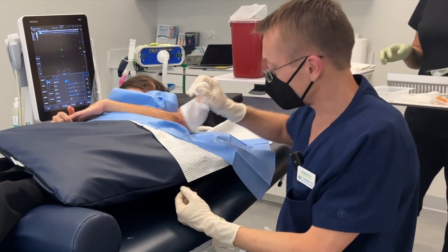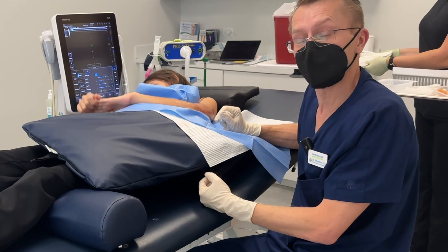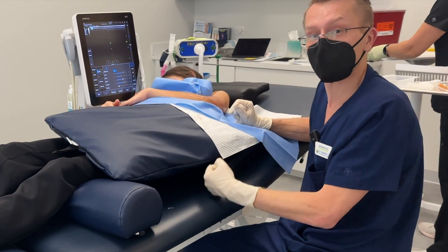So we are done with the hydrodissection. I injected the PRP around the nerve and into the radial nerve. Now she's going to go home, heal, and hopefully in the next couple of months we're going to see some return of her function.